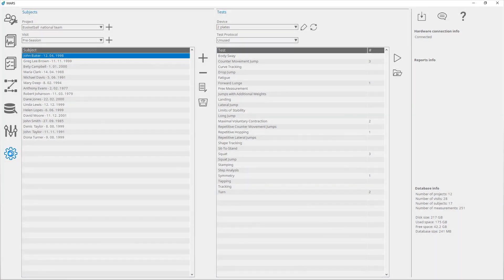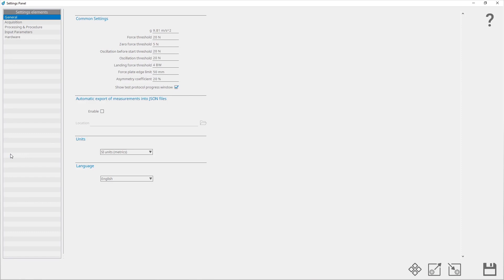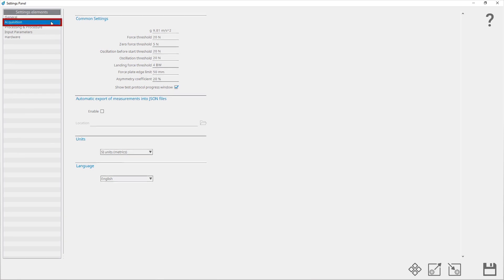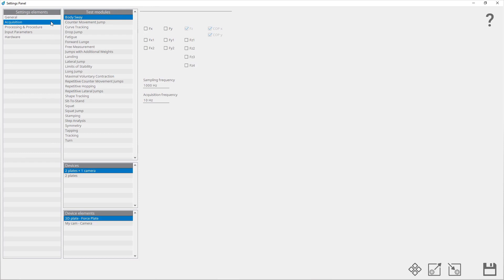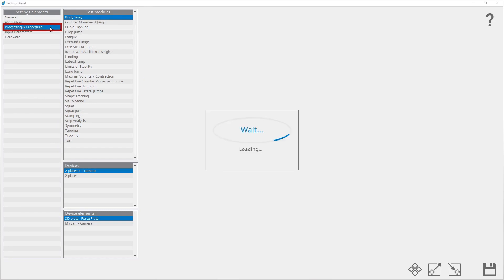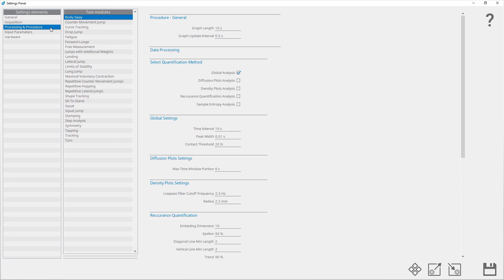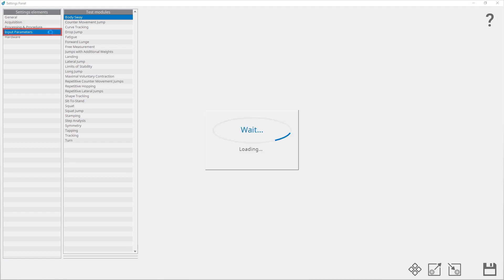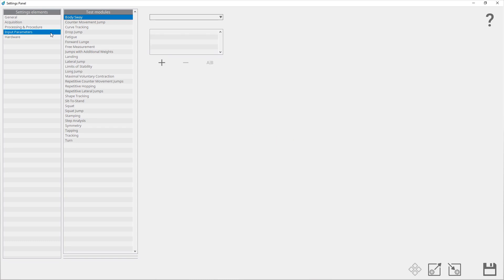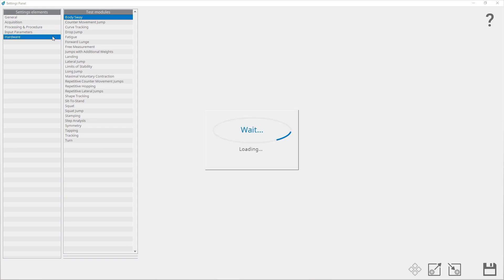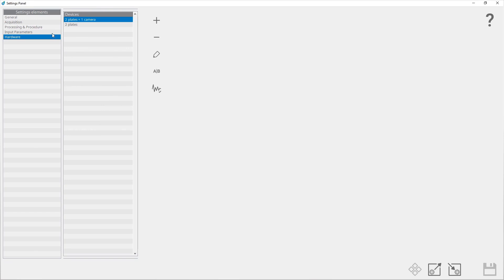The settings panel window consists of five different panels, which are listed on the left side. Under the general panel, the basic functions can be set up. Under acquisition, settings regarding the acquisition of data from the force plate and camera can be set. Under processing and procedure, settings regarding the calculation of parameters and data processing can be set. Under input parameters, new input parameters can be added. Under hardware setup, one can edit the properties of a configured plate and camera, or add a new device.